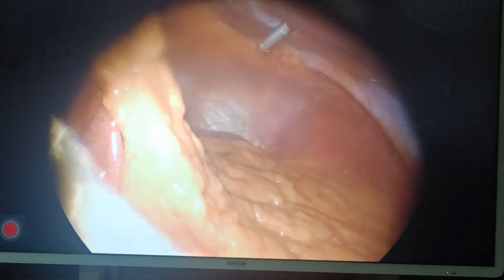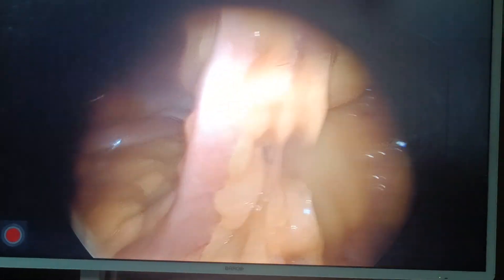The Palmer point looks safe here. Now I will examine the inguinal region and most probably I will put an infra-umbilical port. Okay, thank you.